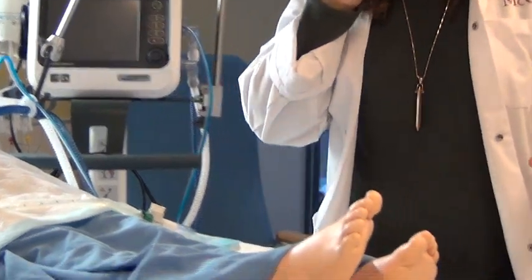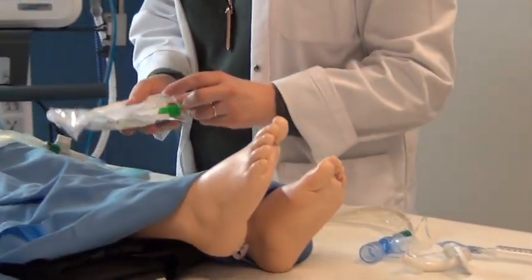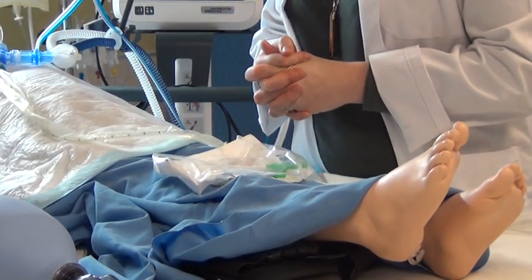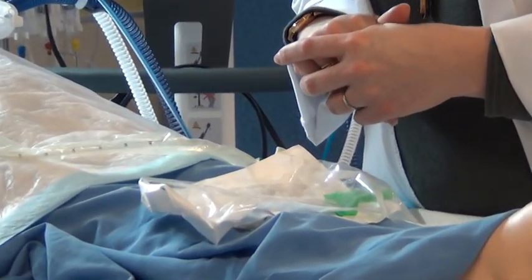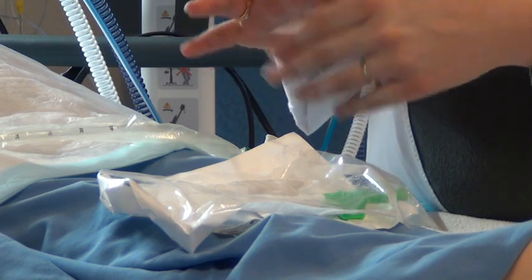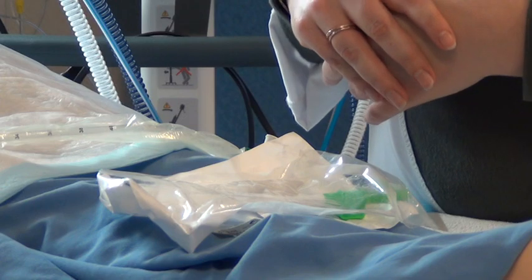Another big role for nurses is actually mouth care. So this is something that you'll likely be doing a lot in some of these critical care settings, especially with intubated patients. Mouth care is required for the prevention of ventilator-associated pneumonia or ventilator-associated adverse events, essentially.